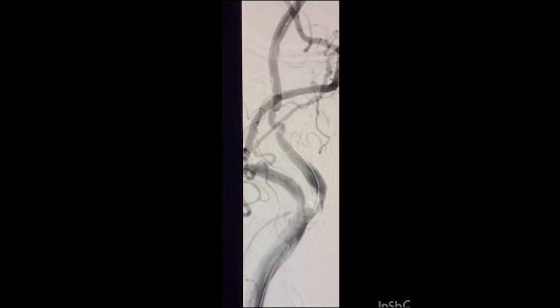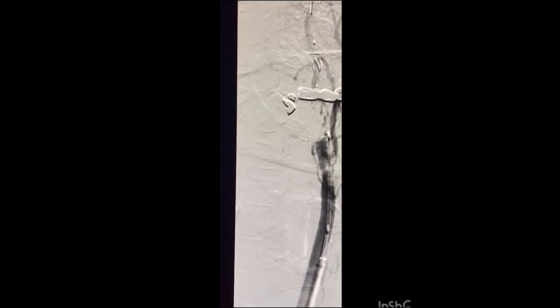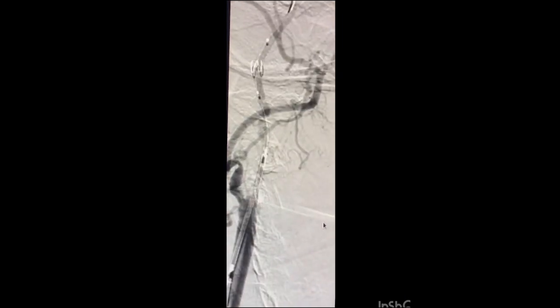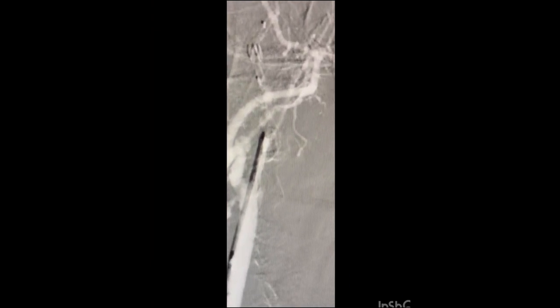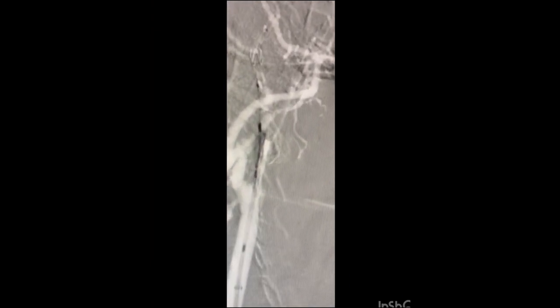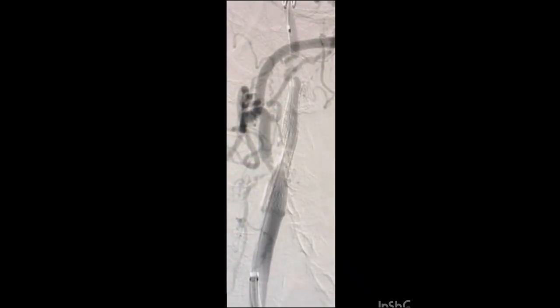Following the balloon plasty, we noted that the patient had predominantly paced beats. The stent was kept in place and a run taken showed significant impairment of forward flow and kinking of the vessel distal to the stent. Post stent deployment, we noted that the forward flow was significantly impaired. There was spasm and kinking of the vessel.